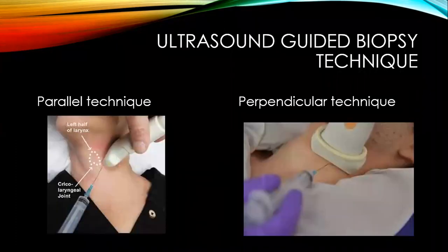Then we move on to ultrasound-guided biopsy of our lymph nodes. This also applies to even thyroid nodules. The same technique applies. So we've got two techniques, and you will notice that different surgeons have different preferences. But as a radiographer or as a sonographer, it is important that we master both, because we will meet surgeons who prefer different methods. So it's for our own good to just master both sides, both techniques.